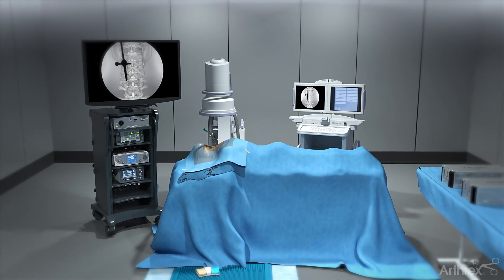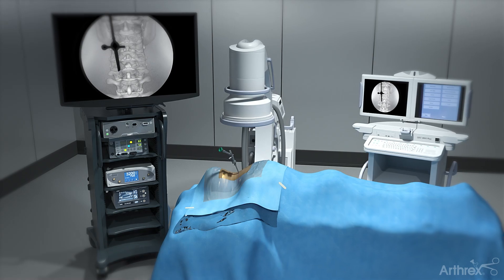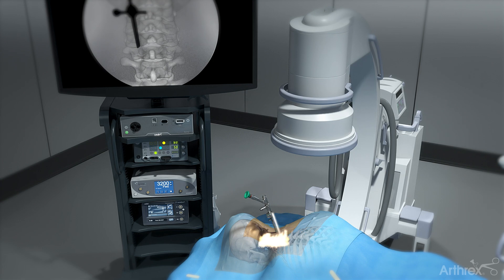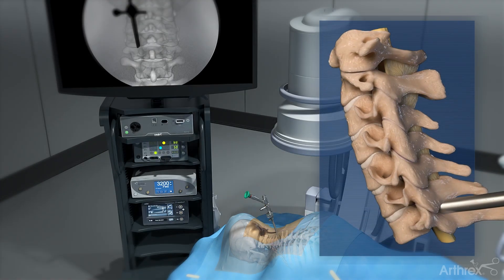The cervical endoscopic unilateral laminotomy for bilateral decompression approach from Arthrix is an ultra-minimally invasive surgery, ideal for patients with central canal stenosis in the cervical spine. In this procedure, the endoscope is used to assist in the approach for access and visualization.